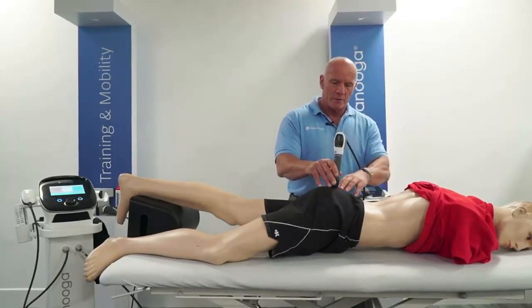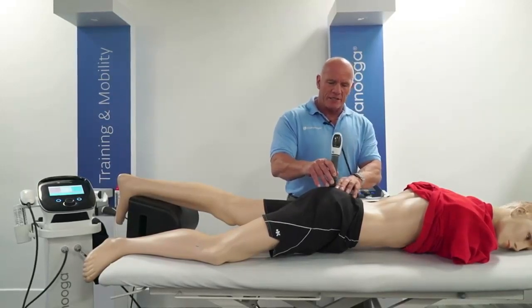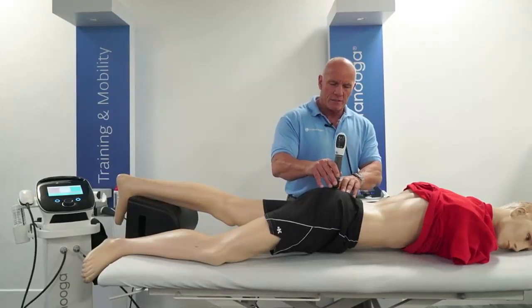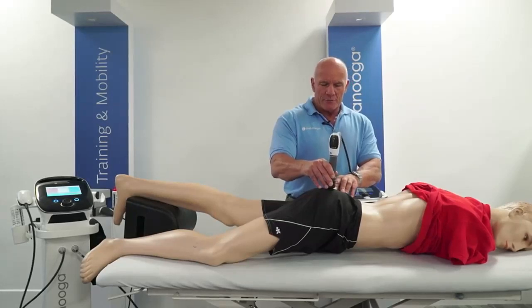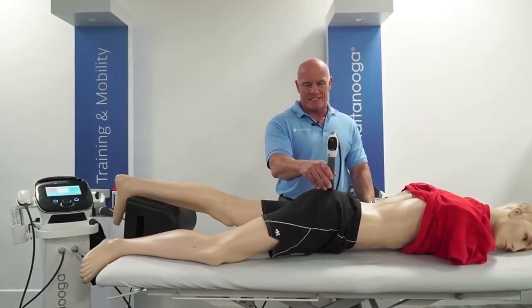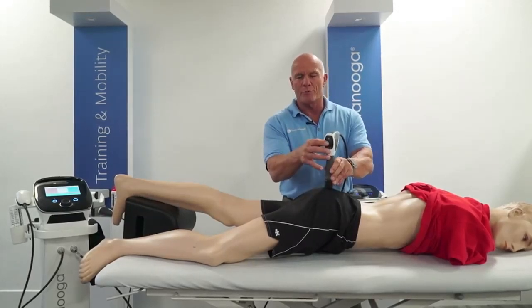So once the patient has told me, oh yes, I'm feeling that, I change from that scanning technique to what they call a stamping technique. That's little circles, and now I'm moving along the orientation of fibers, communicating with the patient, and they say, oh, that is it, you're on it. Okay? Now at that juncture I will pause my handpiece.